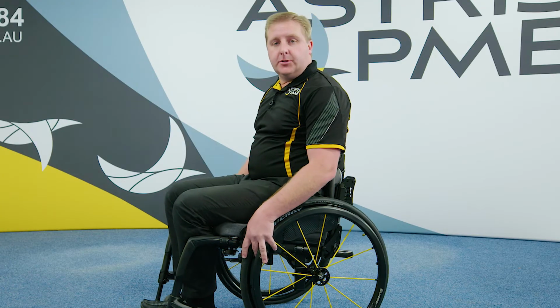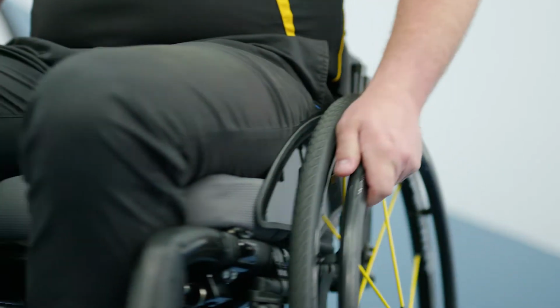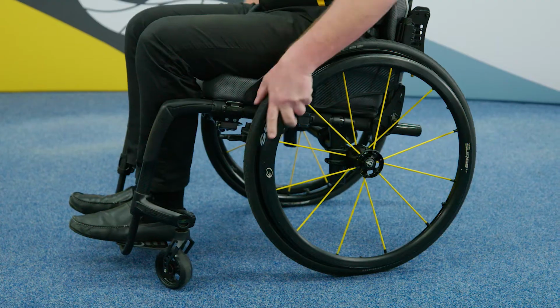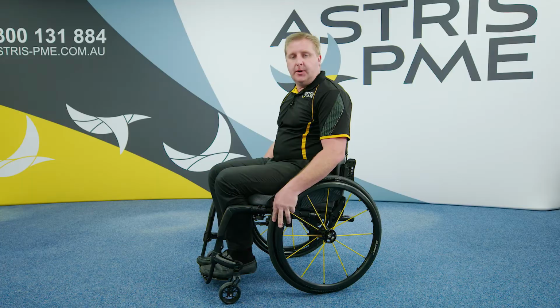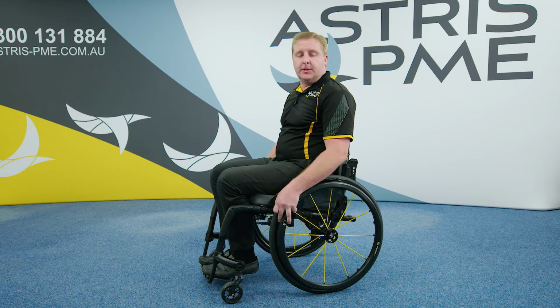For active users, it's quite common to have their wheelchair set up with a good wheel position and centre of gravity so the user can do a wheelie. This stops wear and tear on the casters, but most importantly, it's easy to manoeuvre and the chair will go up and over bumps and humps easier.